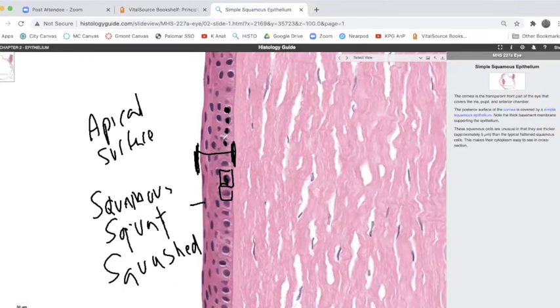And it's non-keratinized, or wet, because these cells are alive right here. These nuclei are darkly stained and they're alive. We'll contrast that when we get to the skin stuff, where we'll see that all the cells in the very top layer are dead.